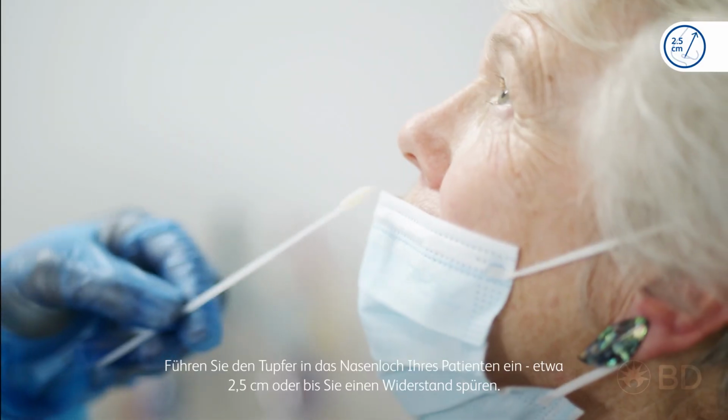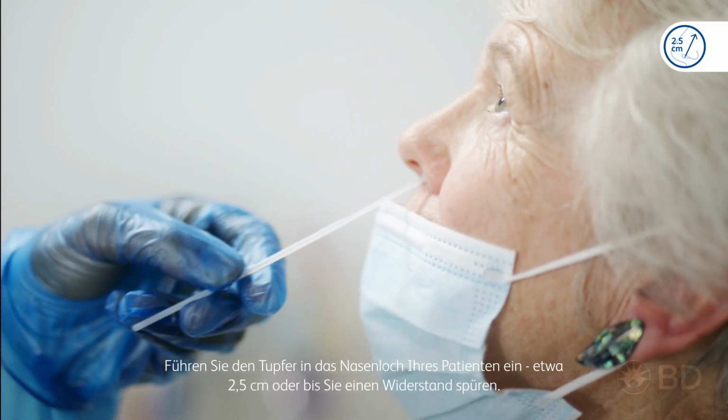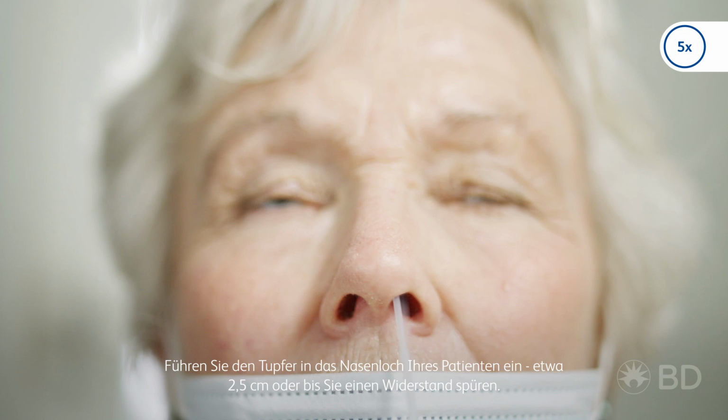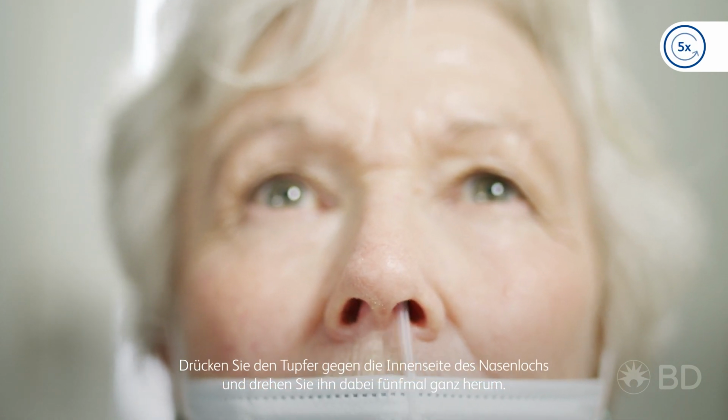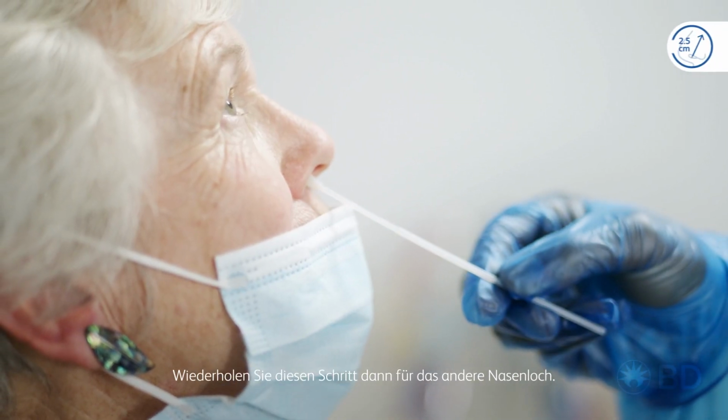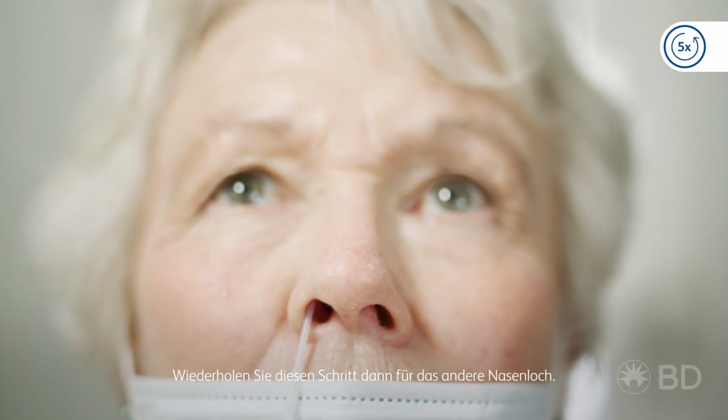Insert the swab into your patient's nostril, around 2.5 centimeters or until you feel resistance. While pressing the swab against the inside of the nostril, turn it for 5 full rotations, then repeat this step on the other nostril.